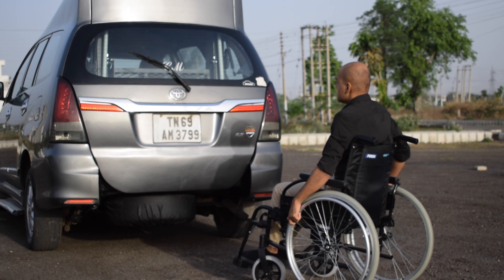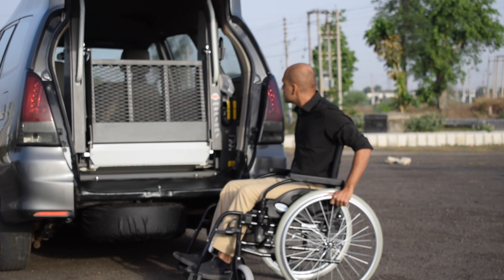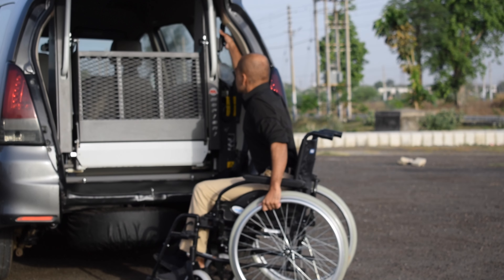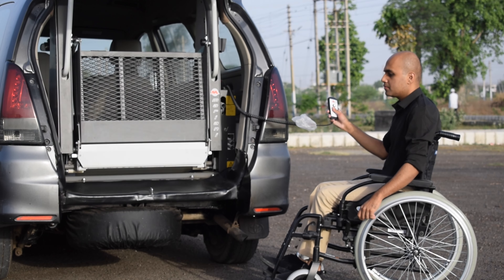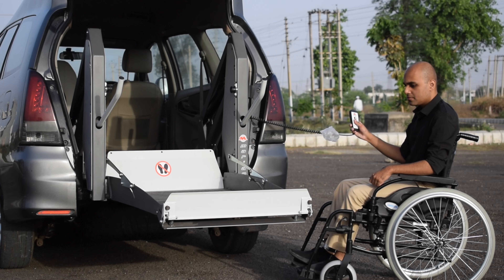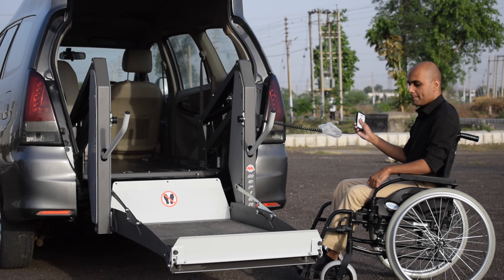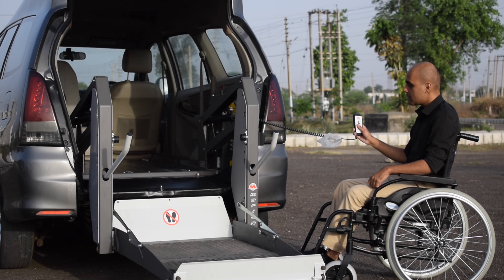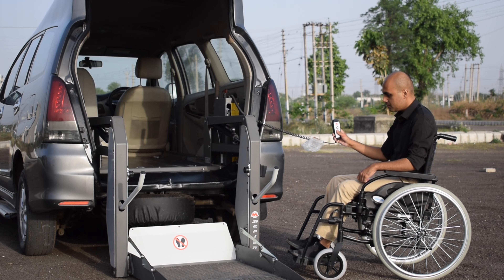The double arm lifting platforms enable the access to vehicles for disabled persons by giving them increased autonomy in movement. This system is actuated by a remote control, which releases the opening and lowering of the platform till it reaches the ground and the subsequent lifting and closing of the platform. These lifts are installed on the vehicle's floor and are actuated by an electro-hydraulic box powered by the vehicle battery.